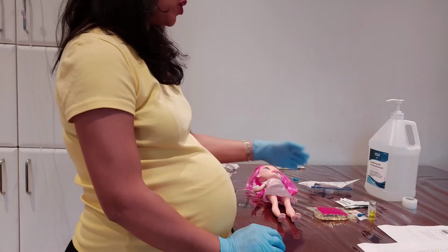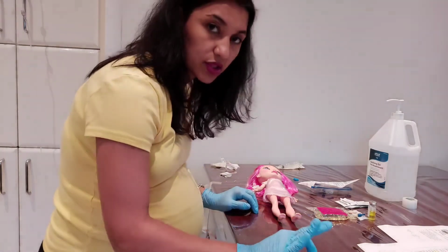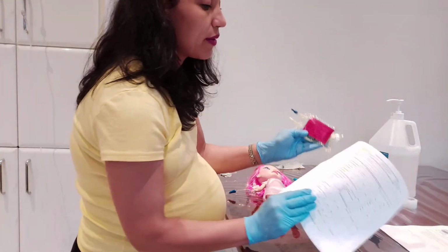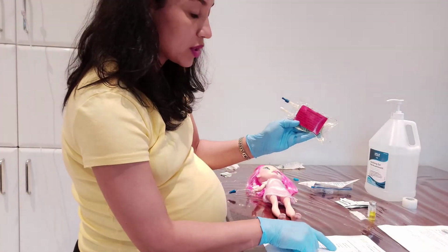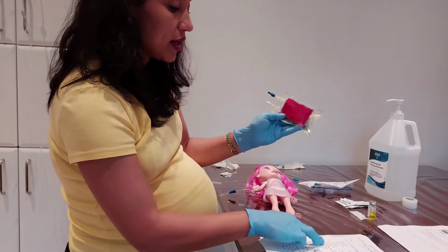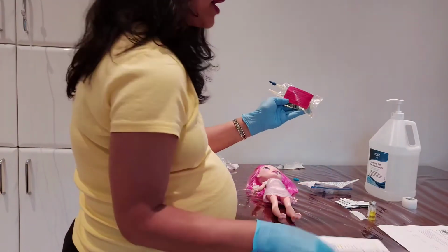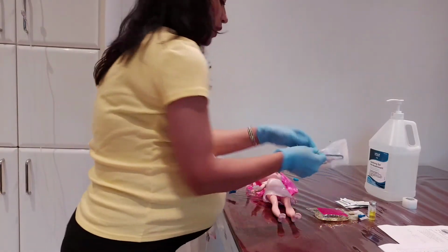Before I continue and open the secondary line, I need to do my third check. I have to check the medication name and the amount, and compare it with the MAR again. The drug name is pantoprazole, so the label is the same, the medication is the same, 40 milligrams, and the time is 8 in the morning. Now I'm going to administer it.